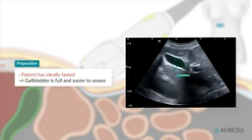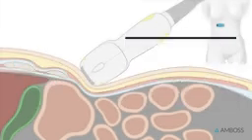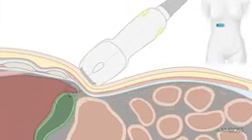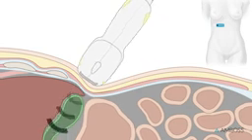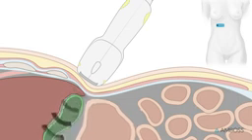This is because in the fasting state, the gallbladder is distended with unreleased bile, which allows for a better assessment. The patient should be instructed to inhale deeply. Doing this shifts the liver, and with it the gallbladder, in a caudal direction. This allows us to use the liver as an acoustic window.